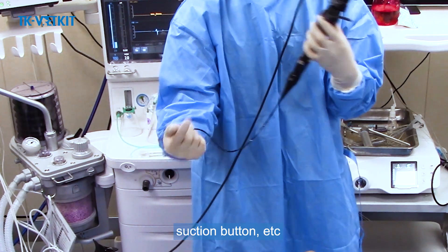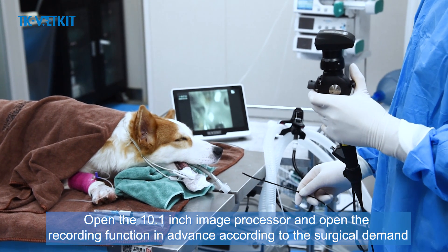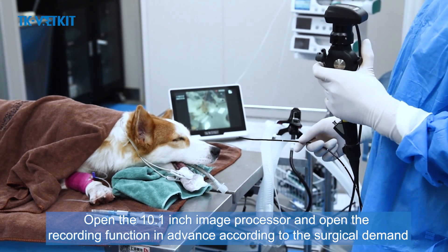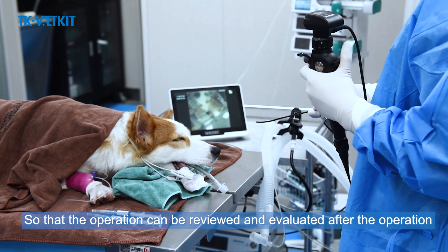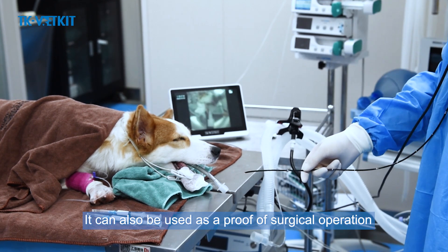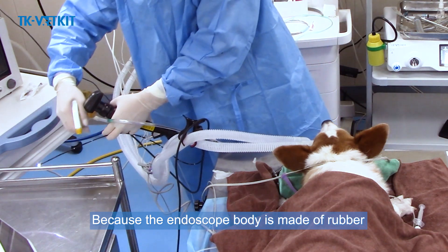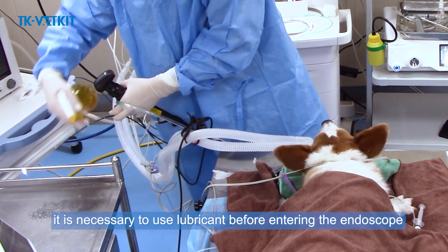Open the 10.1-inch image processor and enable the recording function in advance according to surgical demand, so that the operation can be reviewed and evaluated afterward and used as proof of surgical operation. Because the endoscope body is made of rubber, lubricant must be applied before inserting the endoscope to avoid causing harm to the surgical animal.